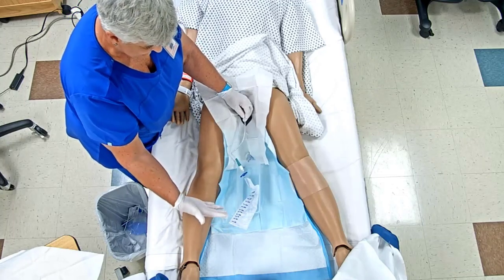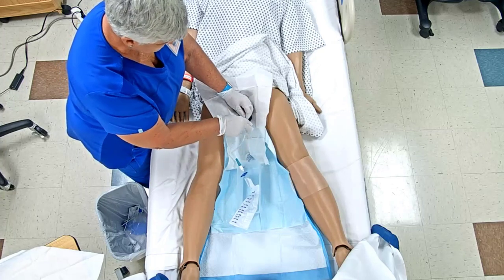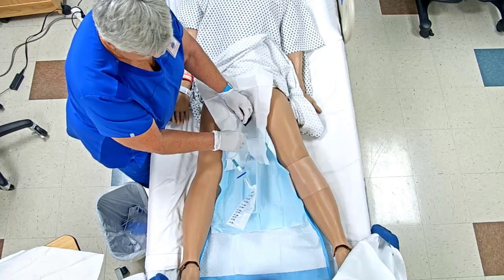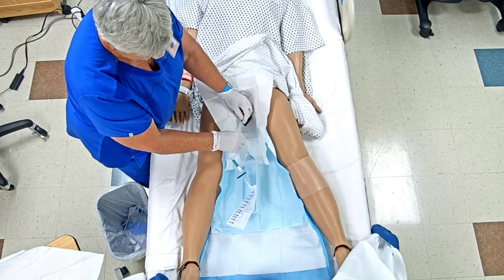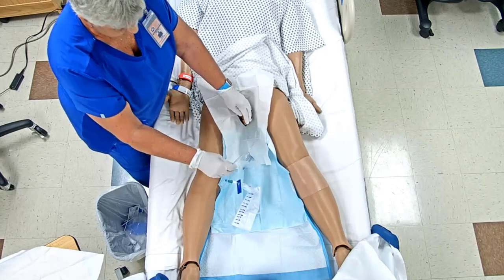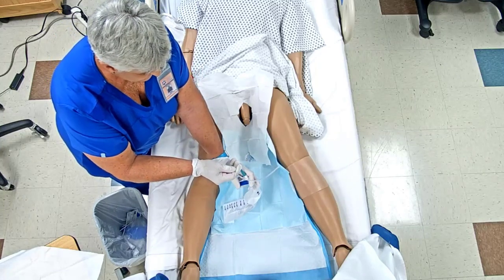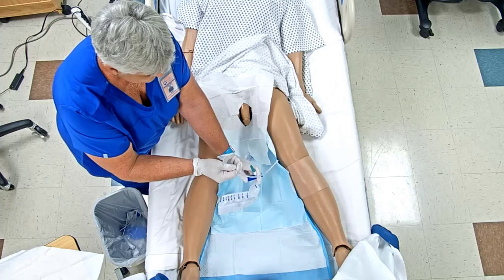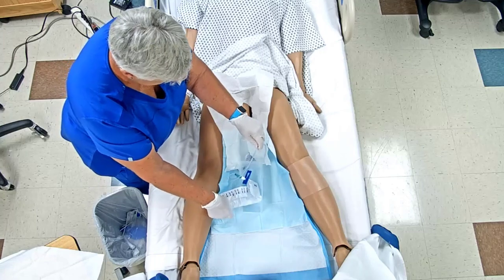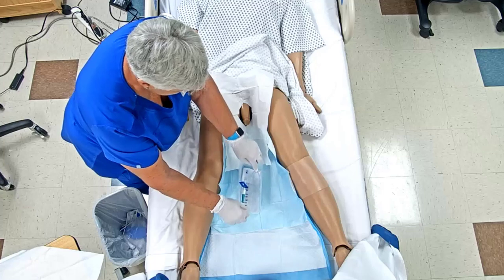Okay, so once I've got my urine out, and then I'm going to slowly take a deep breath. We're going to slowly, and if there's any extra urine, we stop, okay? And we're just going to go ahead and continue to take that out. We're going to drain that into our bag. This is a clamp, so I'm going to clamp it. Okay? So this has got urine in it. I'm going to go ahead and put that back in there for right now.